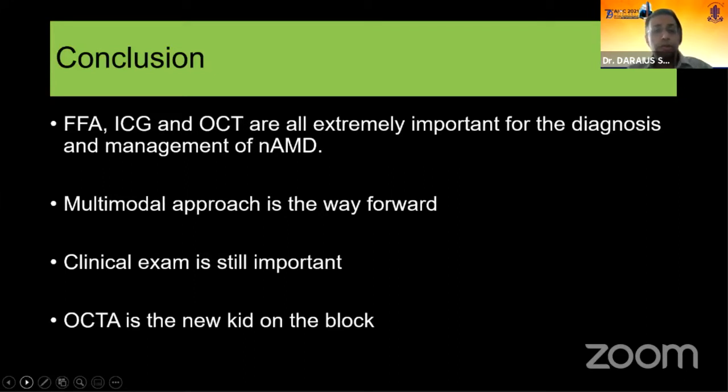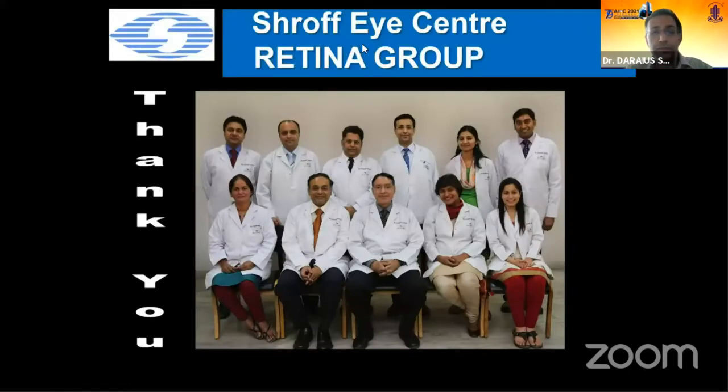To conclude, FFA, ICG and OCT are extremely important for diagnosis and managing neovascular AMD. The multimodal imaging approach is the way forward. Clinical exam is still important, and OCTA, of course, has a lot of applications in the future.